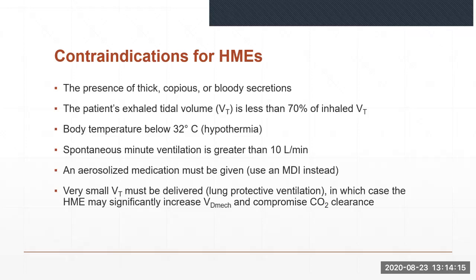HMEs should be taken out of line during delivery of an aerosolized medication. It should be kept in mind, however, that circuit disconnection increases the risk of circuit contamination. An alternative approach is the use of a metered-dose inhaler, or MDI, with an adapter placed between the HME and the endotracheal tube. If a spacer is used with the MDI on the inspiratory line, the HME must still be removed. Another solution is to use a circuit adapter that does not require the HME to be removed during aerosol treatments.